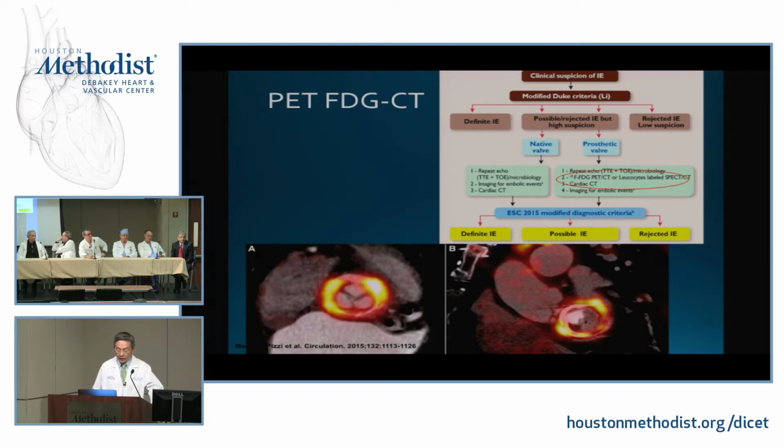Yeah. And one last thing about management of patients with suspected endocarditis and complicated prosthetic valve is PET CT. Obviously, this is an area that we're very interested in getting to. That's already made it to a European guideline for management of infective endocarditis in patients with possible infections after TEE, still with some suspicion. PET CT is a very good option.